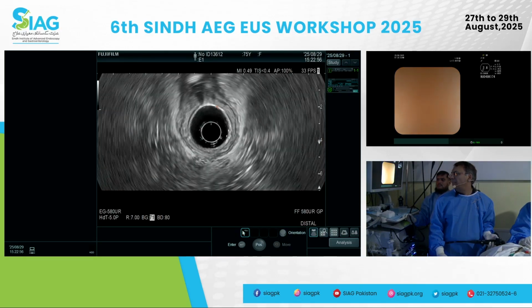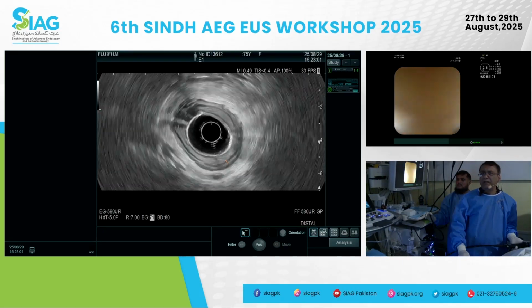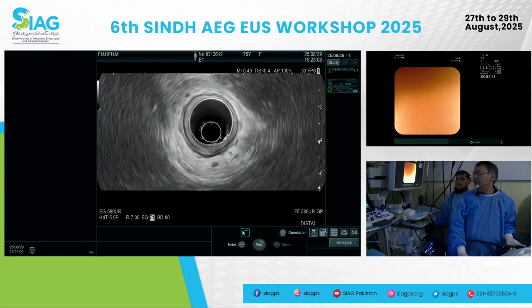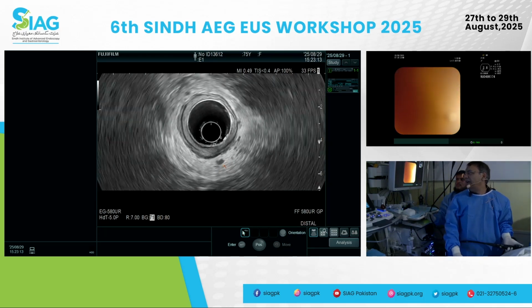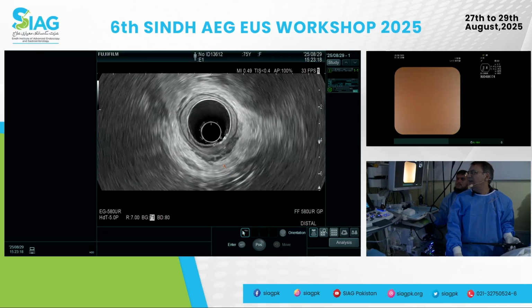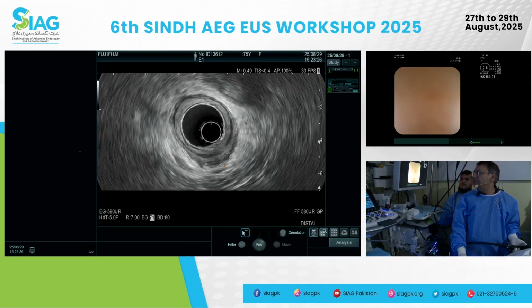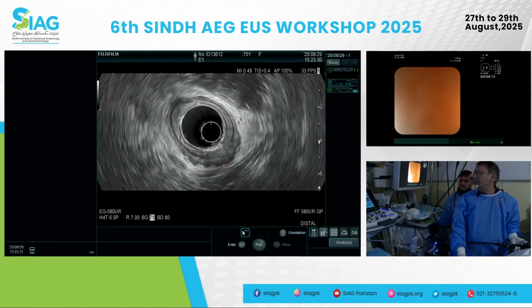Khalid, G., just as you were moving just now, did you see any small lymph nodes? I think they were at the 6 o'clock position. Let me try again. Yeah, there may be, and even if they are, they're not very significant. They look benign. There were small ones, one at the bottom right here, but they look so small. And you see the wall thickening a little bit there. Yes, it's very nicely demonstrated here. Thank you. I think it just looks like inflammation there. You see that wall thickening nicely right there.